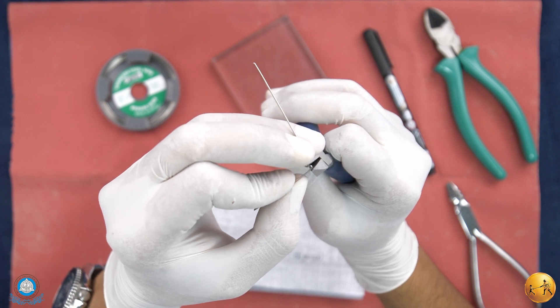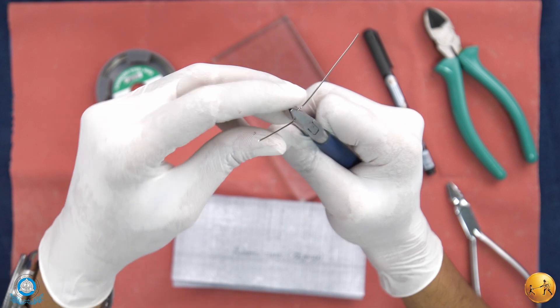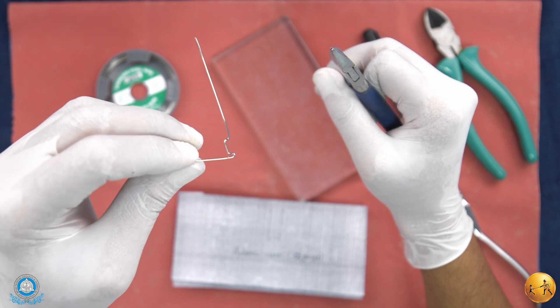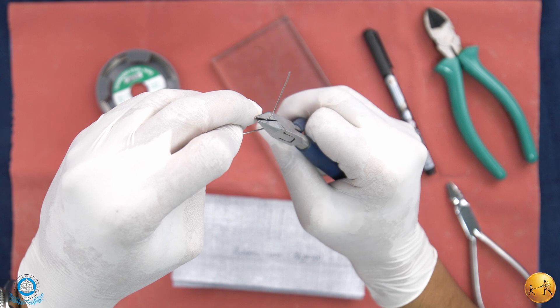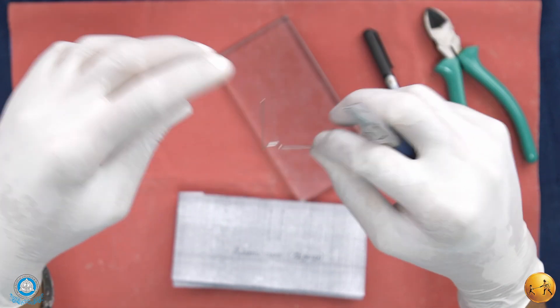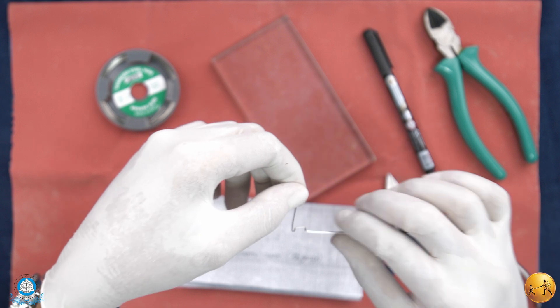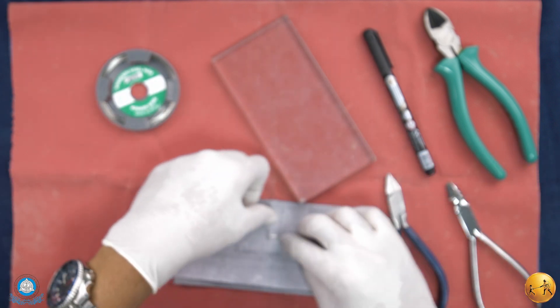With the beaks of your Adams plier, compress the arrowheads. After the first arrowhead is prepared, check it on the outline.